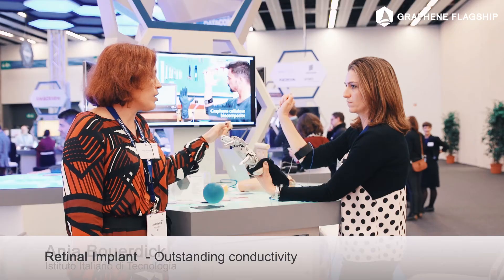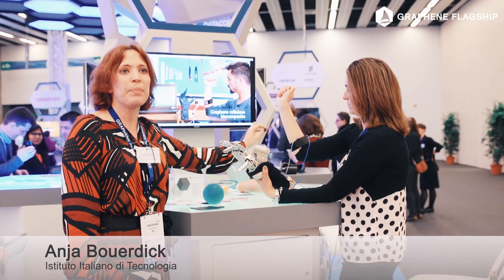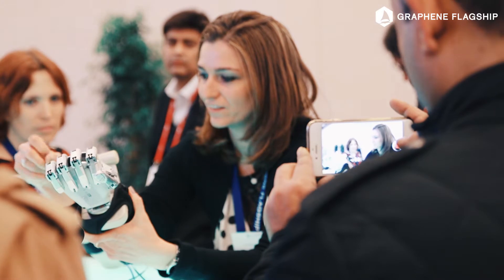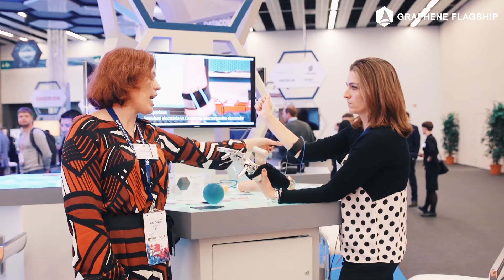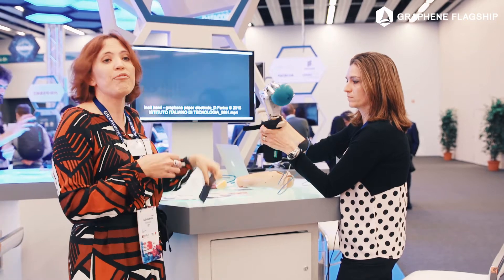This is a prosthetic hand, and in fact it's working by moving the hand through the electrical signals given by the muscles. Normally, commercial electrodes are quite big and heavy and invasive, have cables, and are made of titanium. We started by covering the electrodes with just graphene cellulose papers.